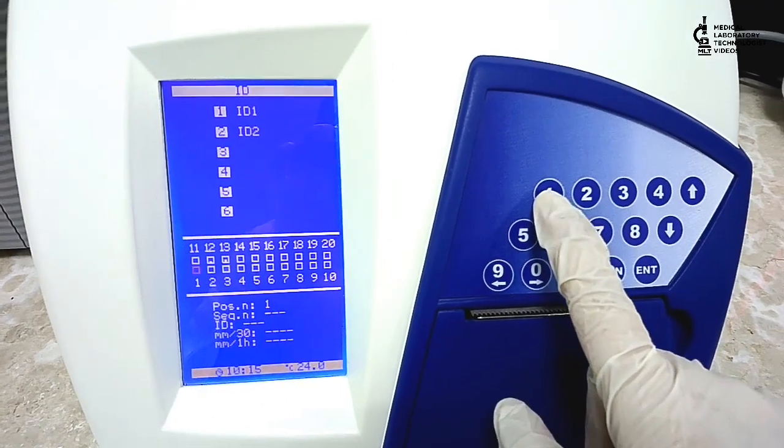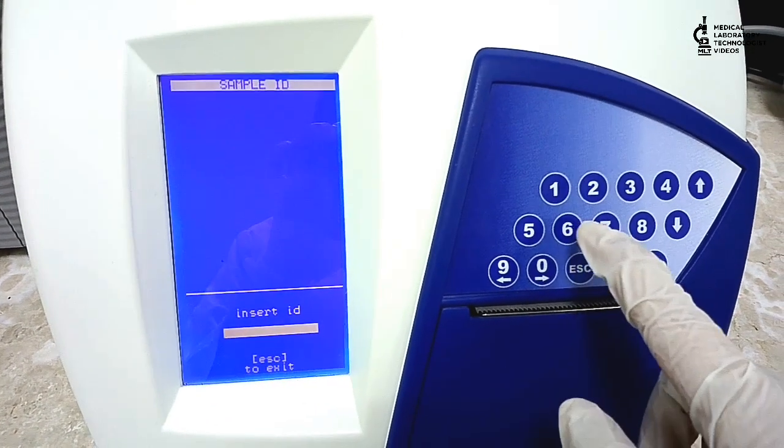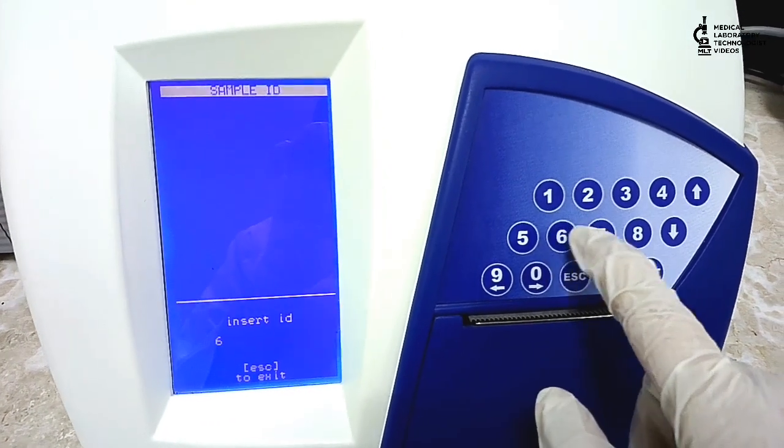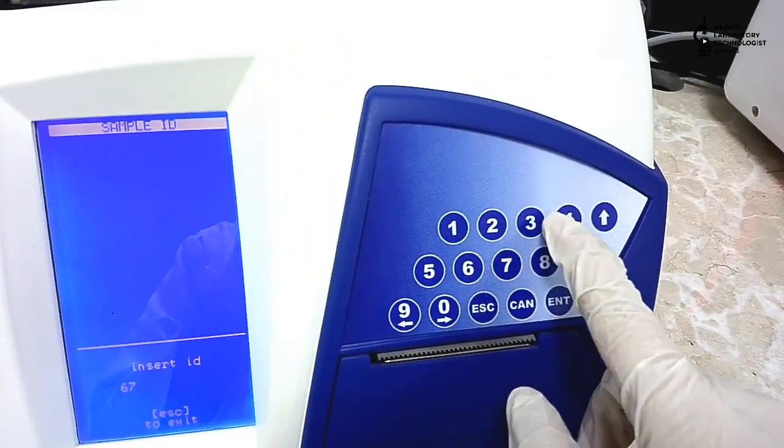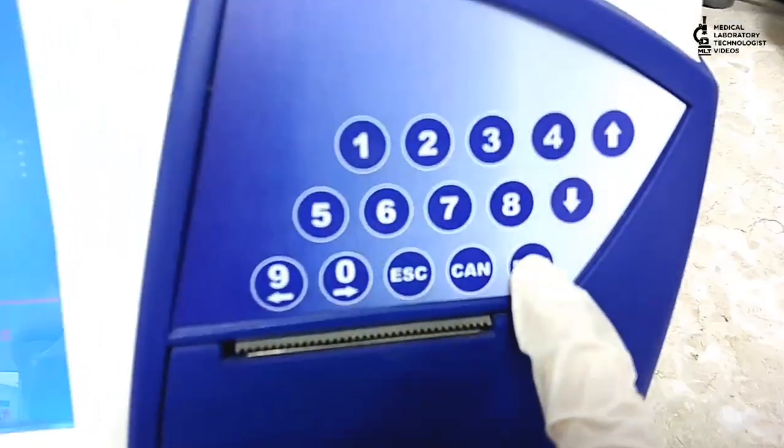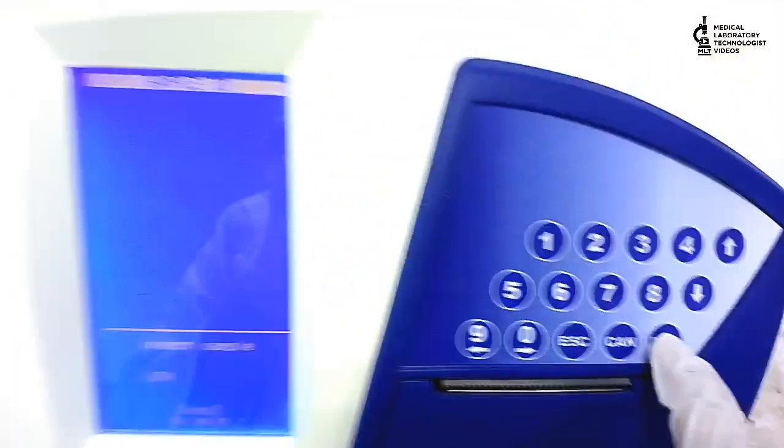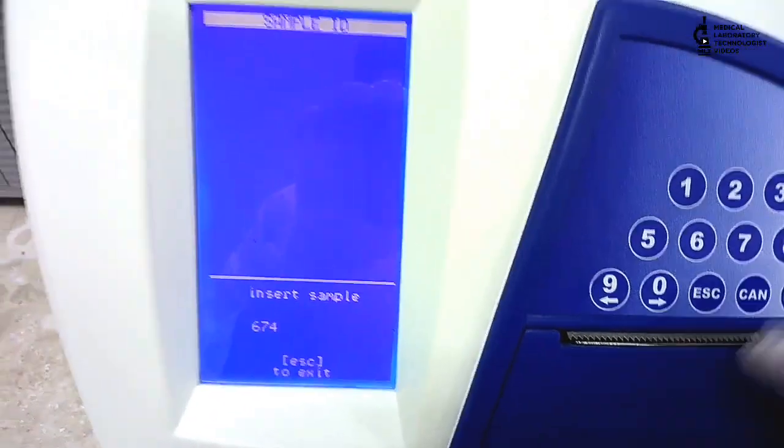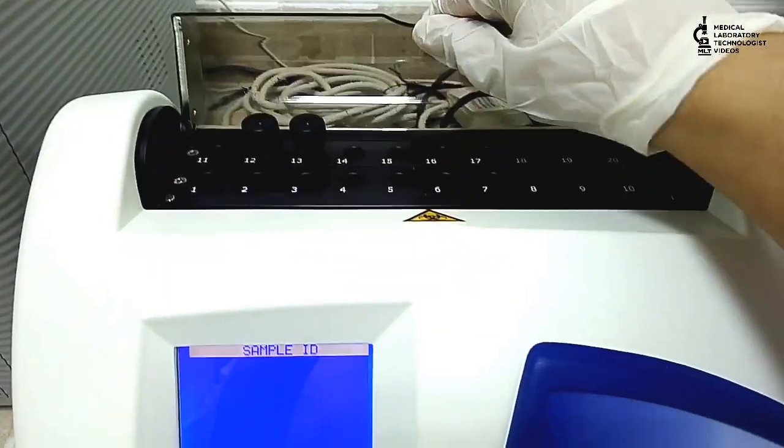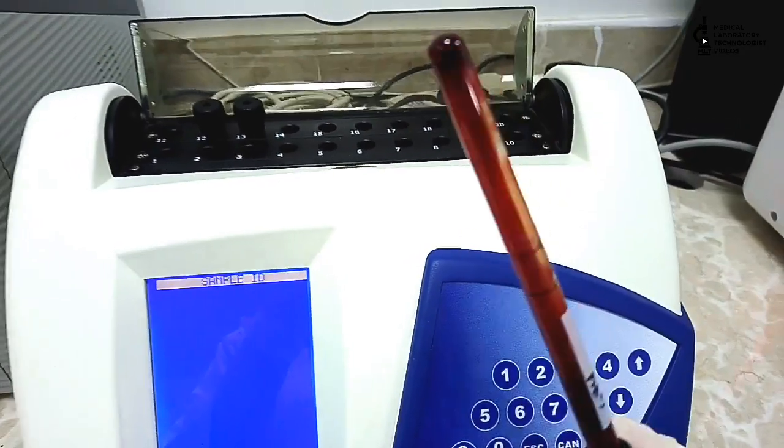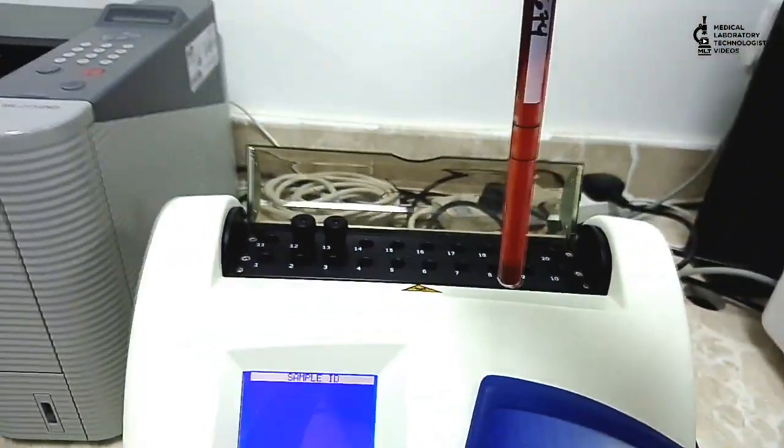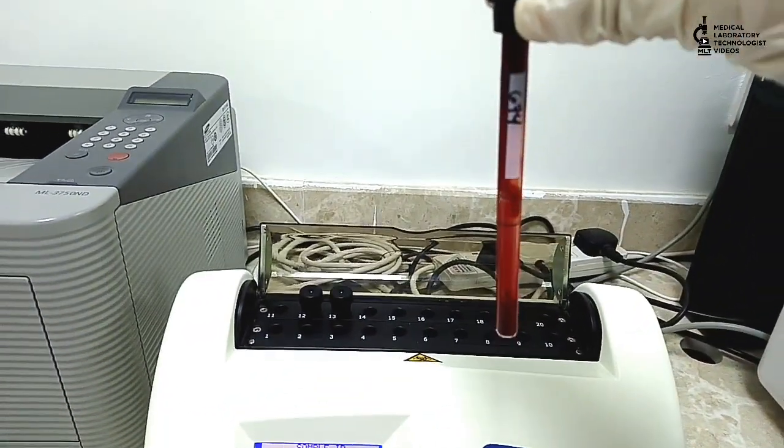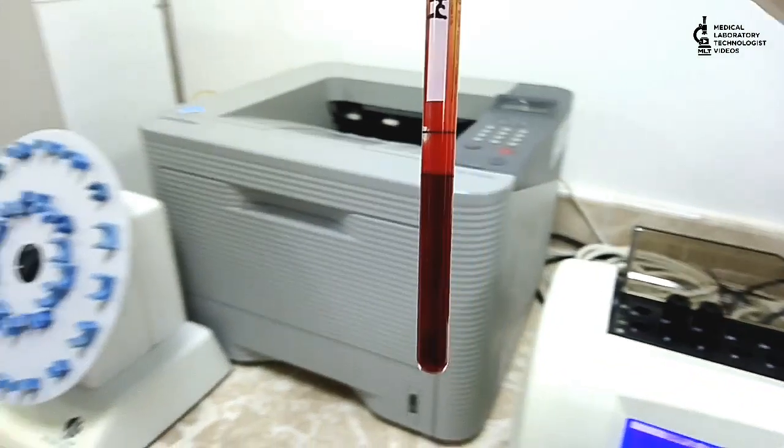Same way, now you see how to run a sample. For sample, we go to ID1, option 1 we choose. Now manually I enter number 164. Now option came insert sample. I will mix first, and now you see it is until the mark.